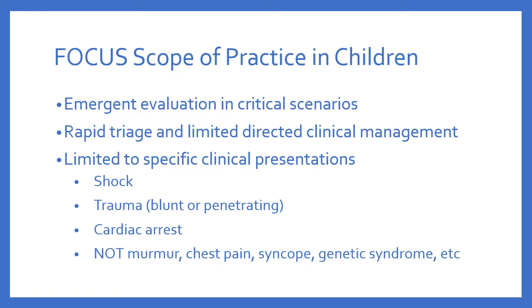So we don't want to use focus when we're just looking for a possible cause of a murmur, or when we want to evaluate chest pain or syncope or some genetic syndrome. This type of exam may have a place for adult patients in these settings, but because of the challenges that pediatric patients present, we really recommend that we don't use it in these types of situations.